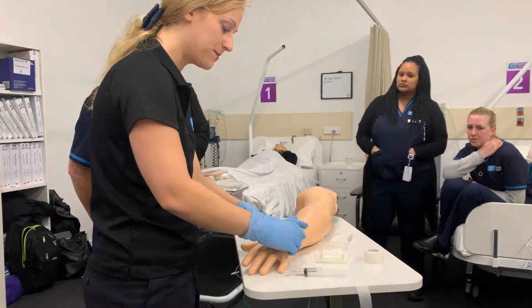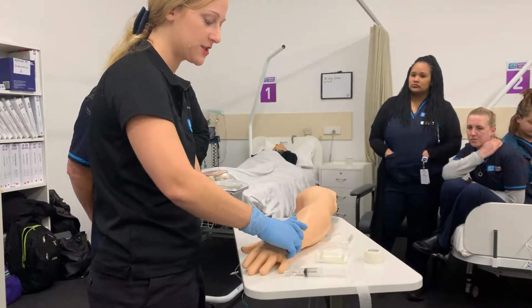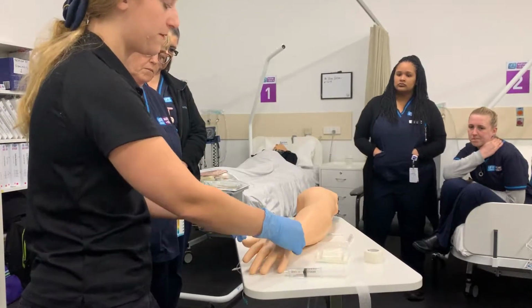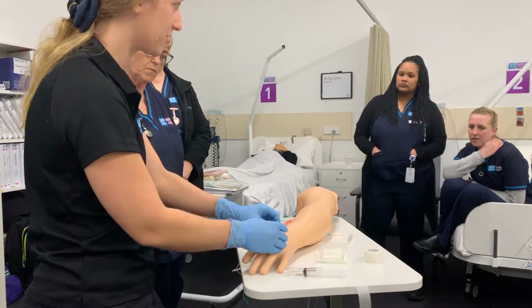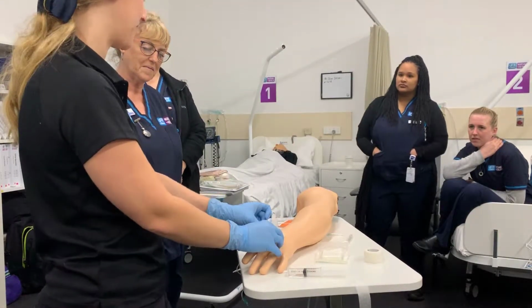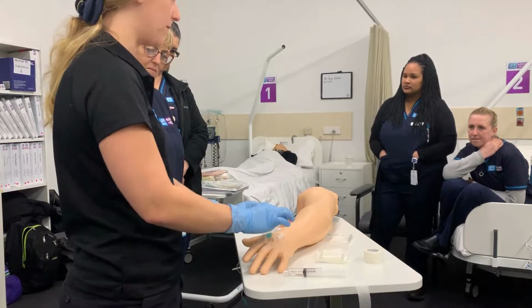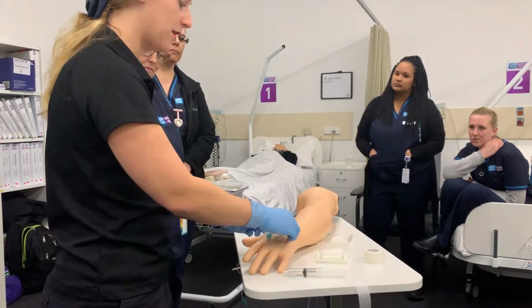So, same as before, you're going to loosen up your tegaderm. Sometimes it helps to roll the edges. If they have fragile skin, you're going to pull. See how it's loosening that way? If they've got strong skin but hairy hands, short, sharp bursts. Tell your patient they're getting a free wax job. Some people pay very good money for this service. Okay? And again, I loosen it till it's about 2 centimeters away from the insertion site. And now I double check I've got everything ready to go.